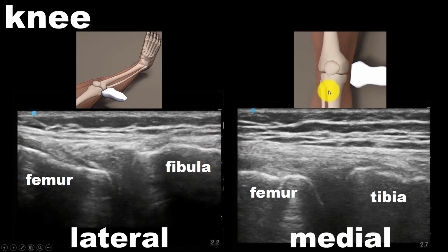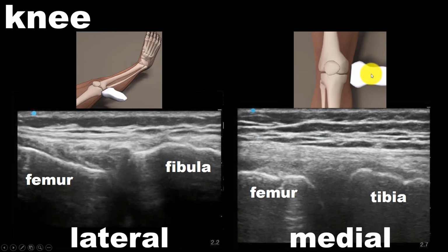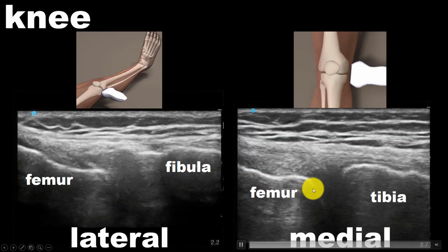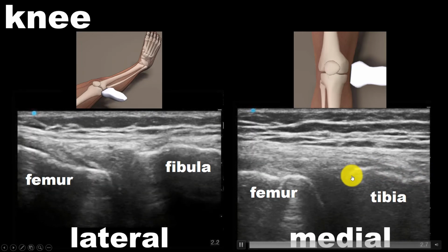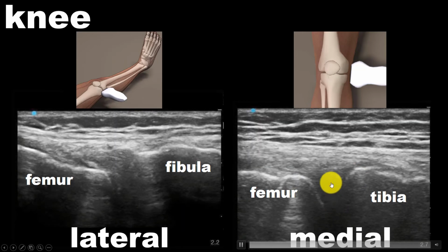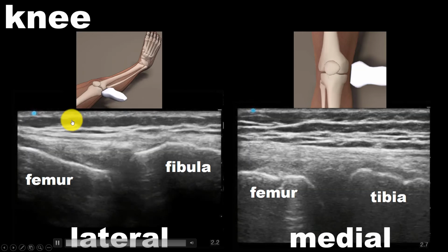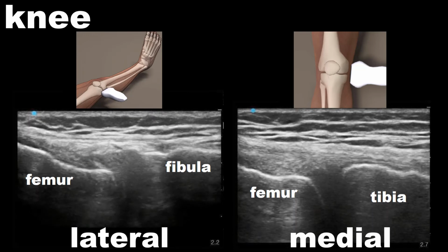You'll actually also see the same thing on the medial knee, so the exact same technique, just done on the opposite side of the knee. And what you're seeing here is, again, the femur bone dive down, and then the tibia bone here start. And they almost form this somewhat like seagull appearance. And again, this is a normal joint. I'm not seeing a dark anechoic collection in here. So these joints do not demonstrate evidence of a knee effusion.